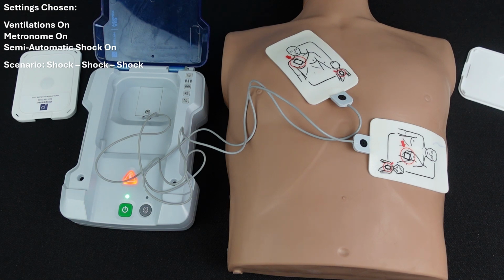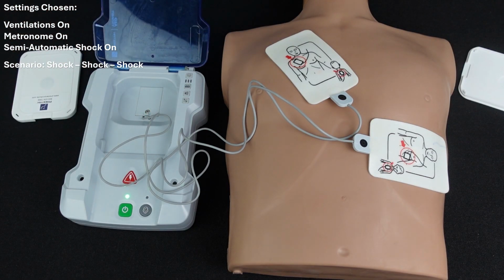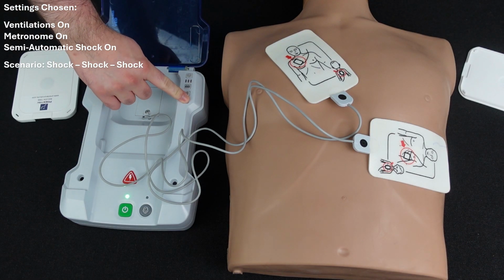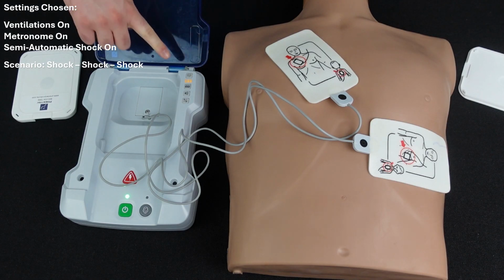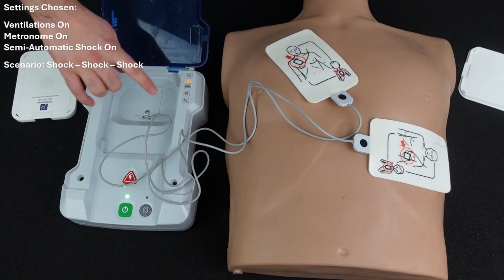Once the shock has been delivered, start doing CPR. If the metronome is on, the AED will click at the correct compression rate. If ventilations are on, then you will be advised to administer 2 breaths every 30 compressions. If you need to pause the training session, the play pause button can be pressed. Click the button again to resume the training session where you left off.